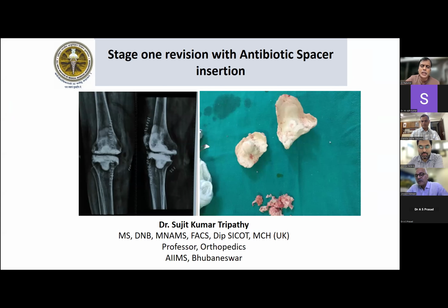The metaphyseal bone loss, a huge metaphyseal bone loss. The proximal bone loss, yes, most of the time. Sometimes even the largest cone sleeve may not be a good option. So here we have to use this cone as a bone filler. Like we put the sleeve and have a good bone filler, like a big sleeve component, because it has got a good titanium.